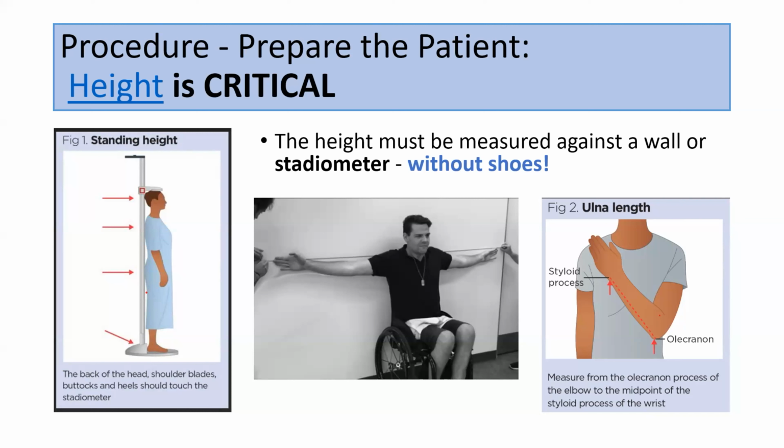Now, this person was trying to get into an occupation that they wanted to work in. And military, first responders, and some other types of occupations require that the patient document that they're not going to have any particular respiratory problems, particularly if there's any history of asthma or other respiratory issues in their medical history. So they have to come and do this.